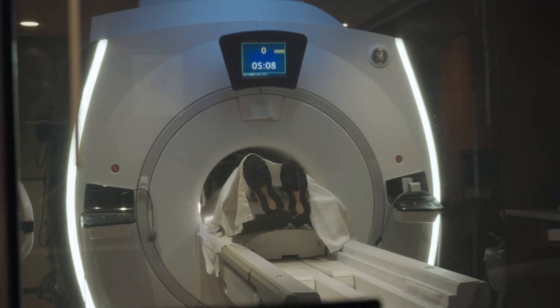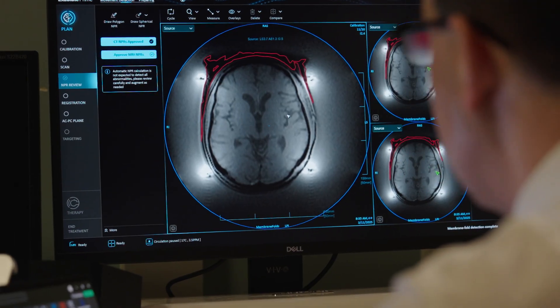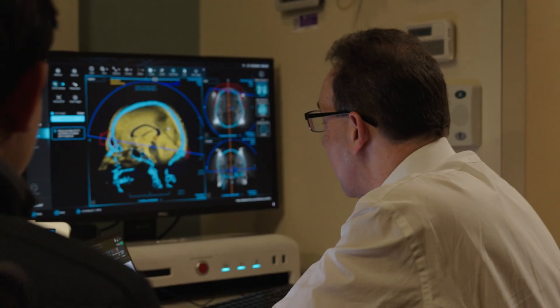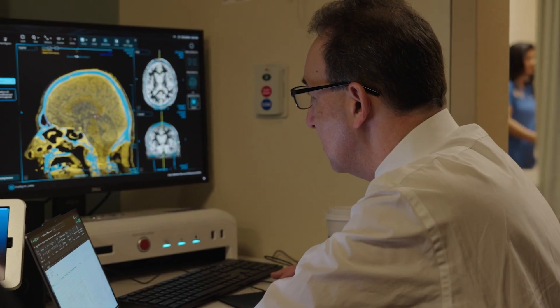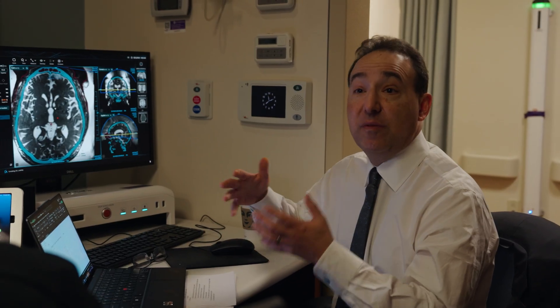We've taken initial scans here in the magnet and merged those in the computer with the preoperative image. We've then used that to pick reference points within the brain that allow us to select an initial target. The initial target in the brain gives us a first place to test to see if this is the best place to create the permanent lesion or whether we need to move a bit.